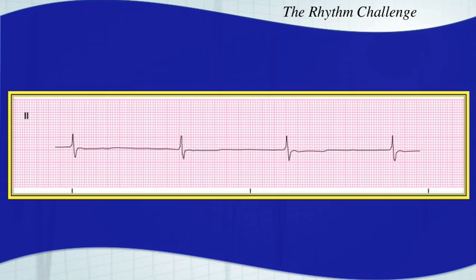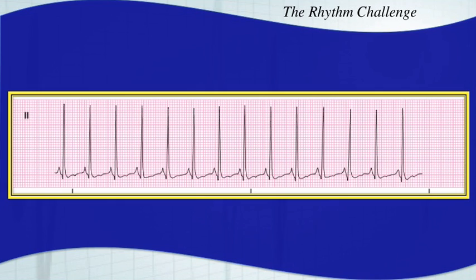Take a good look at this rhythm. You might notice something's missing. That's because this is a junctional escape rhythm — slow, narrow, and very regular junctional escape. No atrial activity.